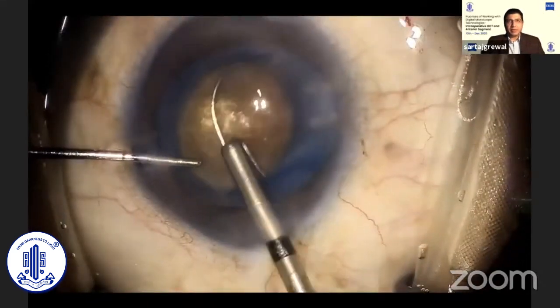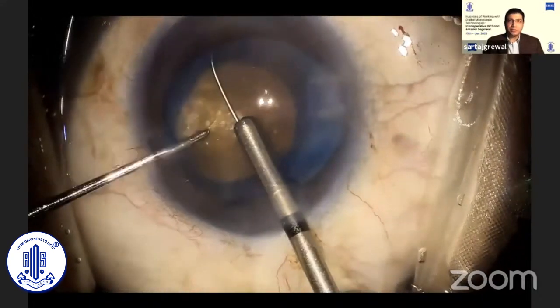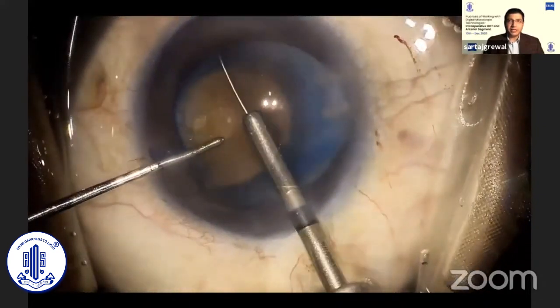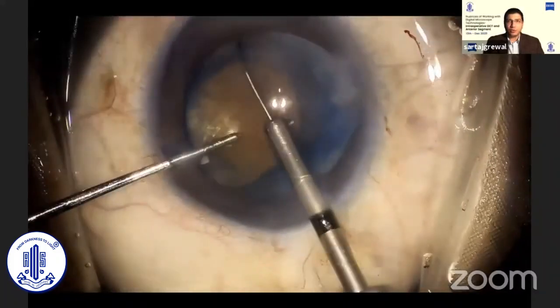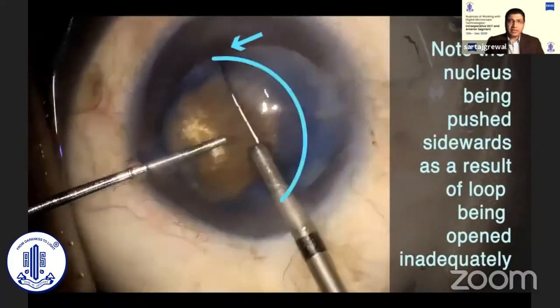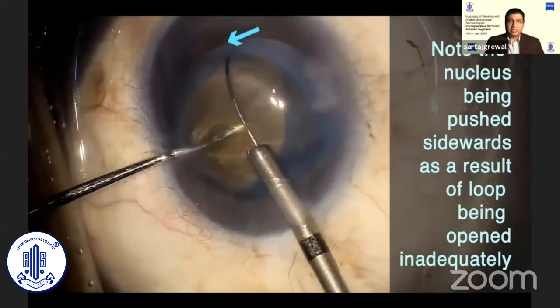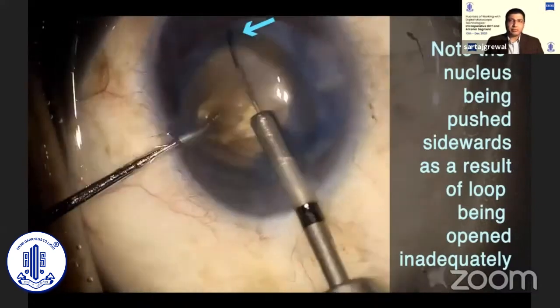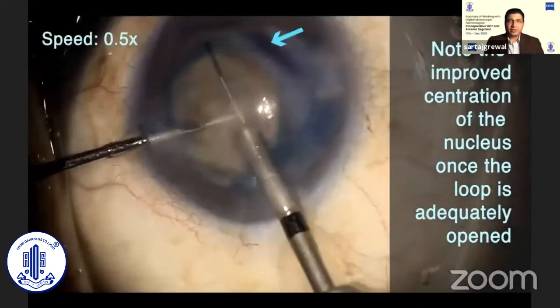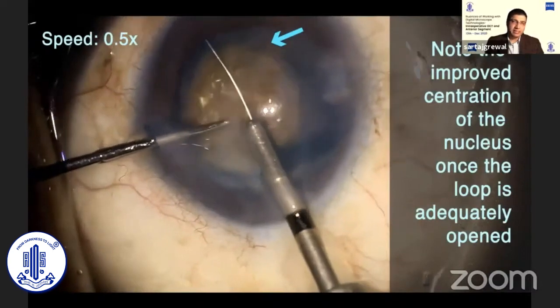This particular step comes with a learning curve. This video shows my very first attempt at using the MyLoop. After inserting the instrument, expanding the loop, and trying to rotate it clockwise, I struggled with getting the loop over and around the center of the nucleus. I even tried to use the second instrument to help nudge the nucleus to the center, but with no success. After struggling for quite some time, I noticed that the loop had not completely encompassed the nucleus and was pushing the nucleus away.